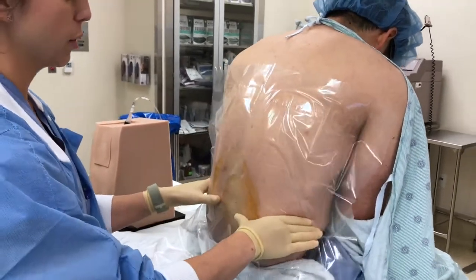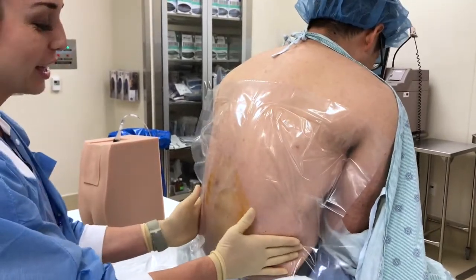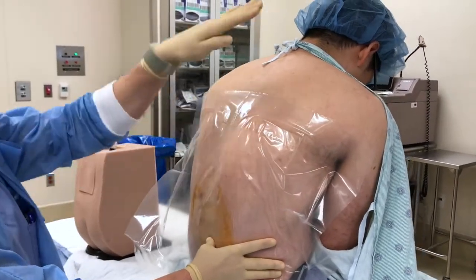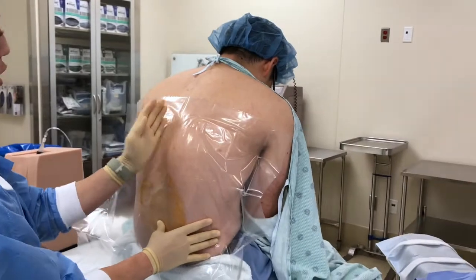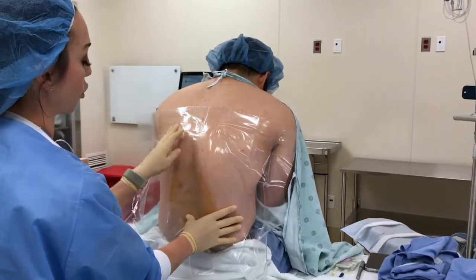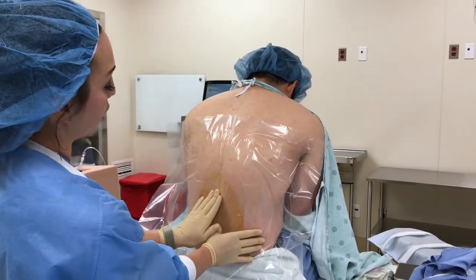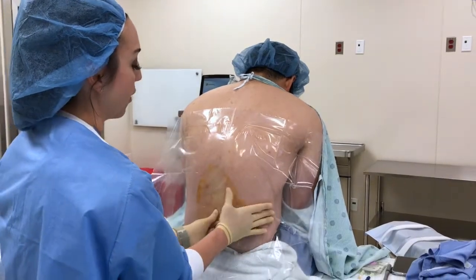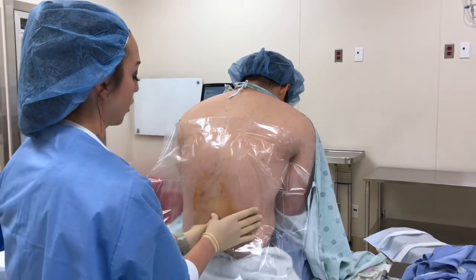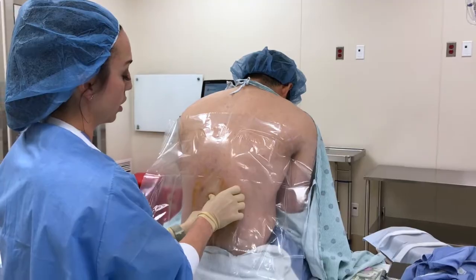And then remember, we go to, oops, sorry, just my hands here. We're going to find the top of the iliac crest, that's L4, and then try to find our midline position. Make sure that their shoulders are even. If they're tilted too far, then maybe their spine will be rotated, or it'll be more difficult to find midline. So we're going to gently palpate midline, find our spinous processes, and then try to intersect that with our L4. And then go either L3, L4, or L4, L5, wherever you feel a good interspace here.